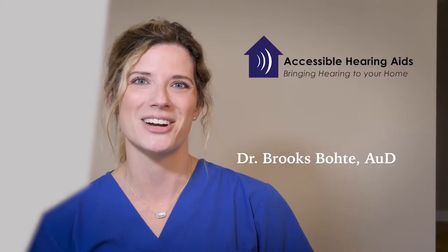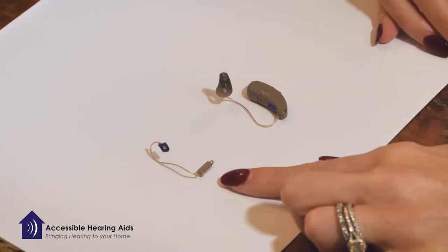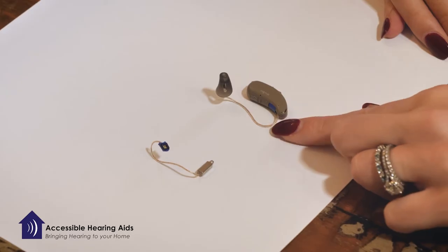Hi, I'm Dr. Brooks Bodie and I work with Dr. Joe Griffith at Accessible Hearing Aids. In this video I'm going to show you how to change a receiver — known to many patients as the wire, or the piece that goes on the outside of your ear.